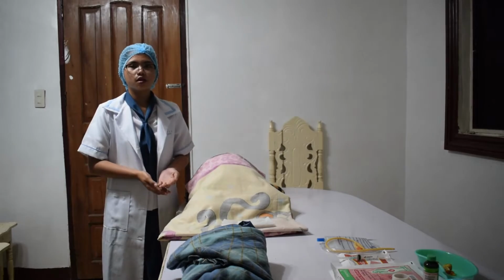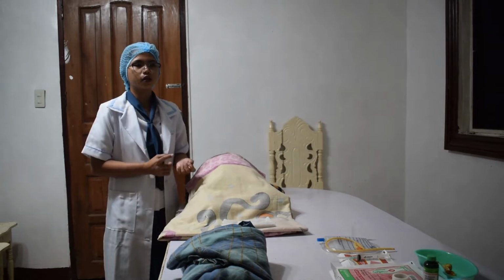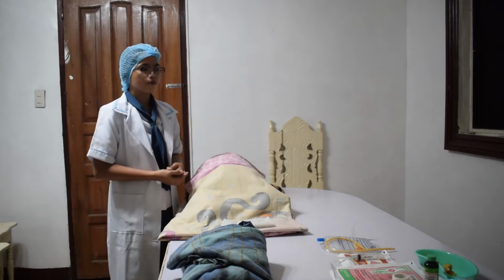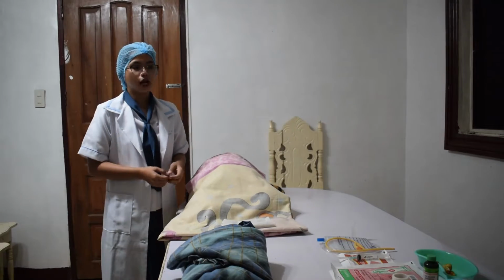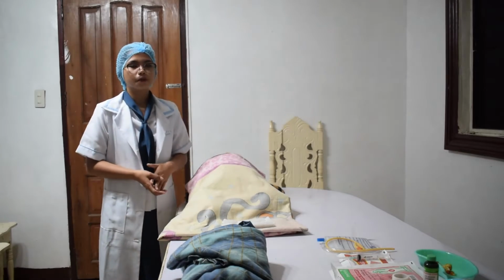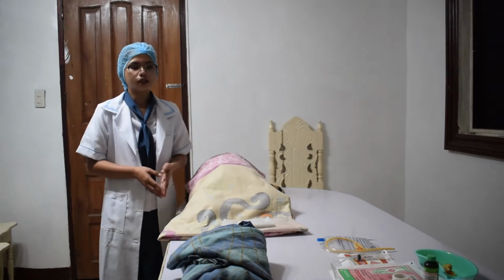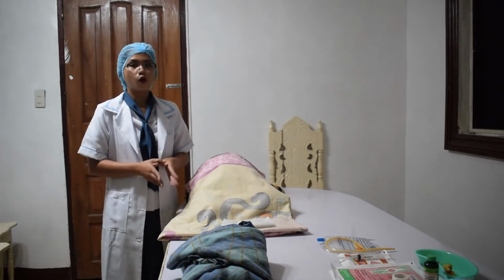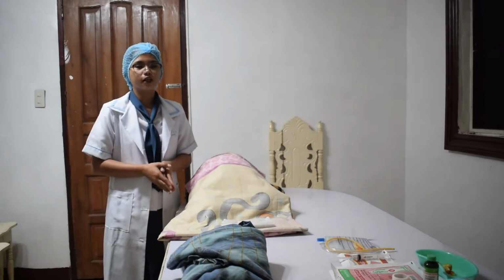Next is prepare materials. The materials needed are a sterile catheter of appropriate size, a catheterization kit or individual sterile items, 1 to 2 pairs of sterile gloves, sterile square sheets, cotton balls with betadine, sterile gauze, forceps, water-soluble lubricant, urine receptacles, a 10 ml syringe pre-filled with sterile water, a drainage bag for urine, a specimen container, a lamp or flashlight as necessary, hypoallergenic tape and safety pin or clip, and disposable clean gloves.